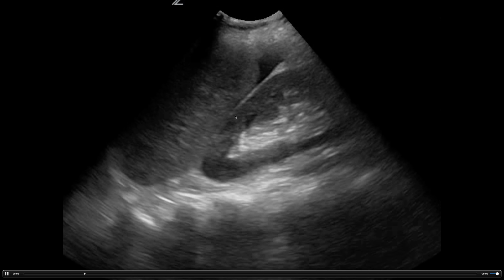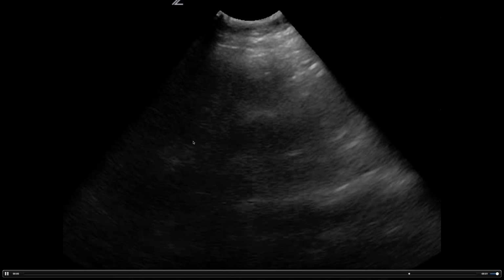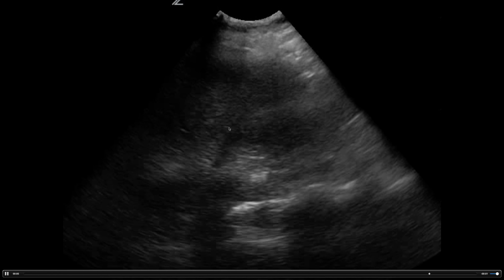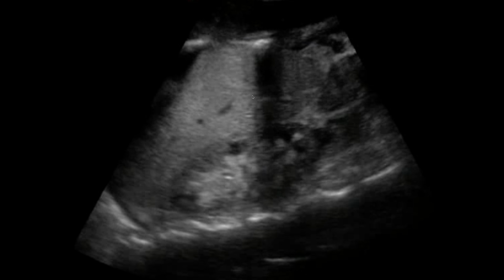Really sharp, jagged, rigid, diving into crevices. Physiologic fluid that's in cysts or bladders or stomach is going to be smooth and nicely contoured. This is sharp and irregular, so that's suspicious for blood or ascites, depending on your clinical situation.